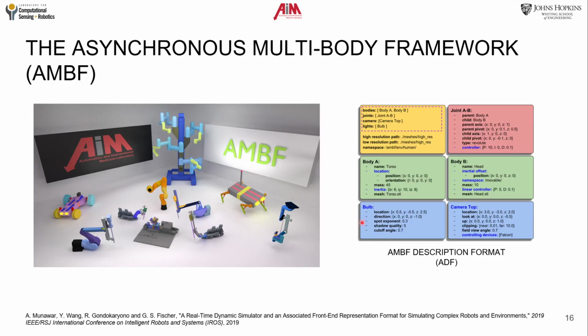We designed the asynchronous multi-body framework with this limitation in mind. AMBF allows the pairing of multiple input devices with different update rates with a real-time dynamic simulation. In addition to this, AMBF is a robust simulator that allows the simulation of robots and mechanisms which are defined using the AMBF description format.